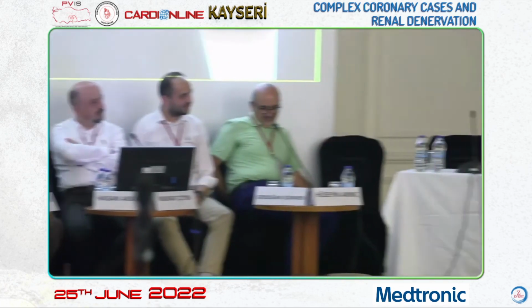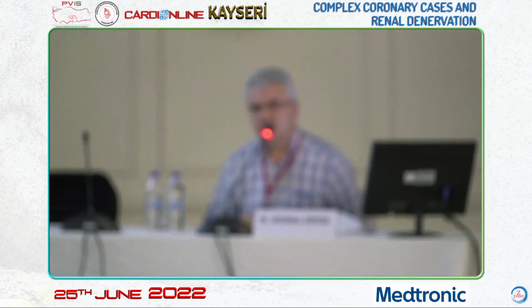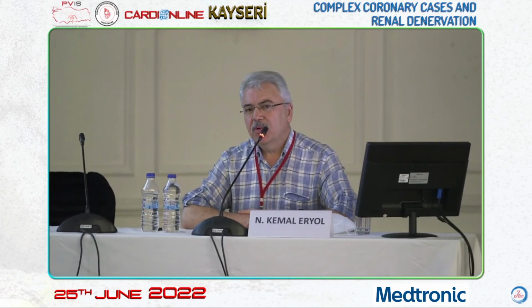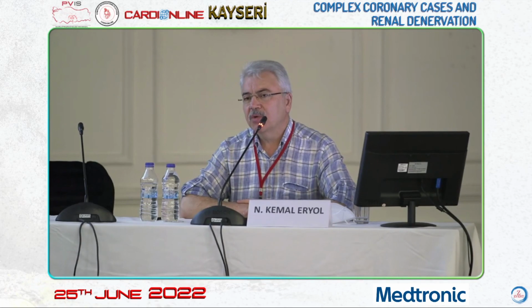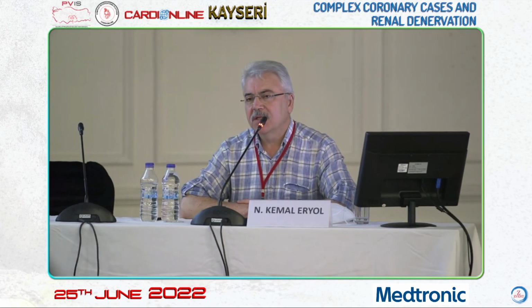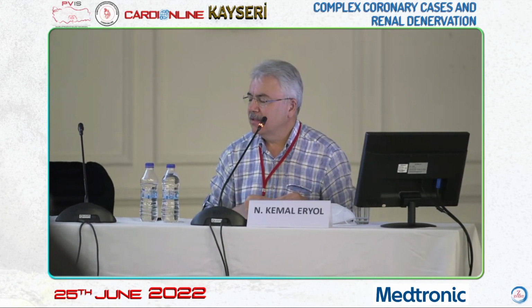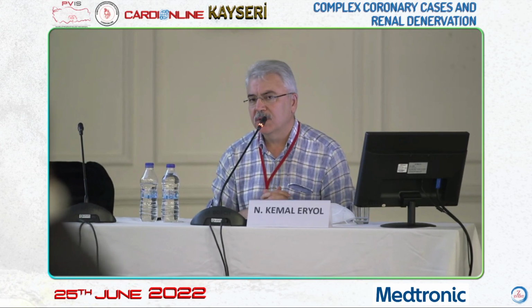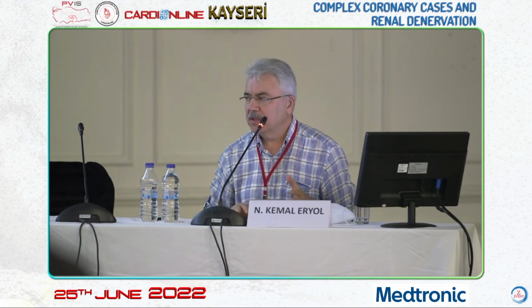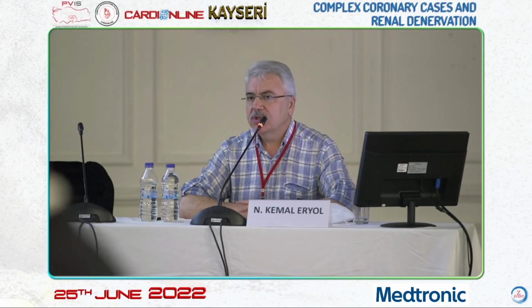And with tiny vessels, of course, we do not want to increase the metal load much. Drug-coated balloons would give us that chance, especially in provisional stenting of side branches. A secondary stent will not be required. So such advantages of the drug-coated balloon are good.